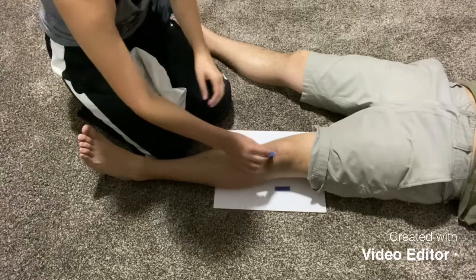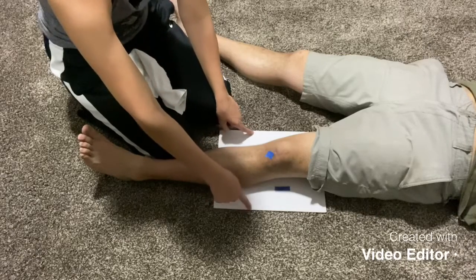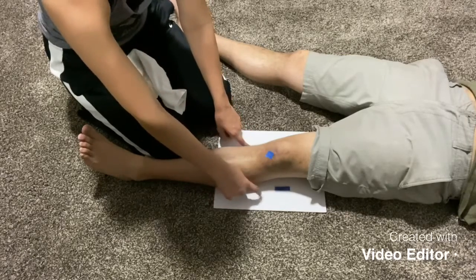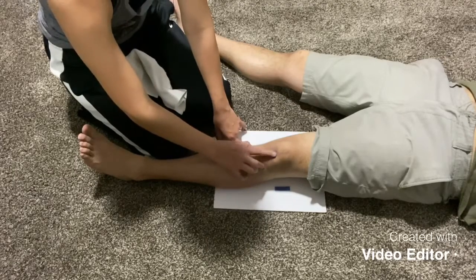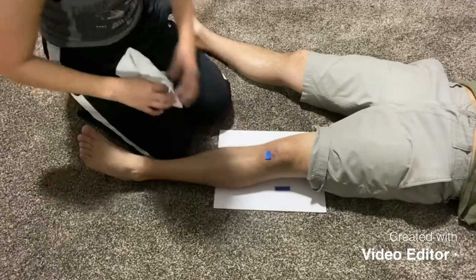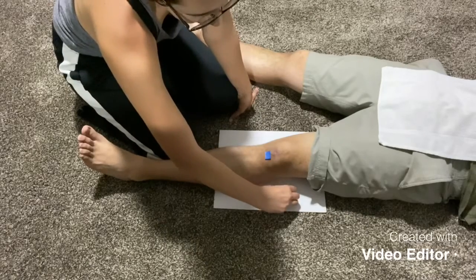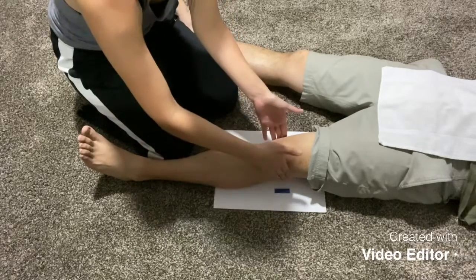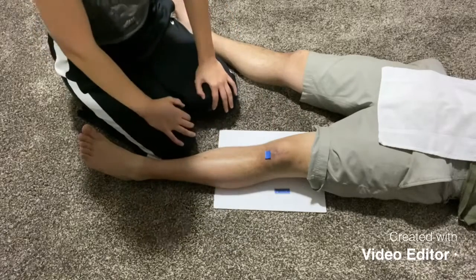For my collimation on this exam, I'm going to collimate to 8 by 10 inches and then bring it in an inch on either side of the leg. Again, centering 1/2 inch below the patellar apex. And shield the gonads, place our left side marker for the left leg, make sure there's no rotation, and click for our AP knee.